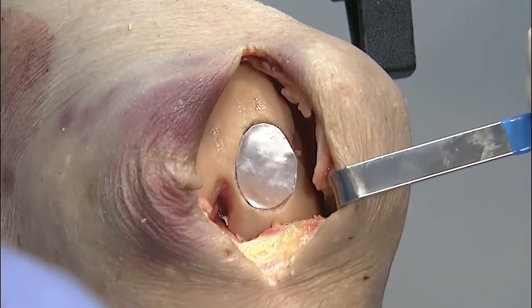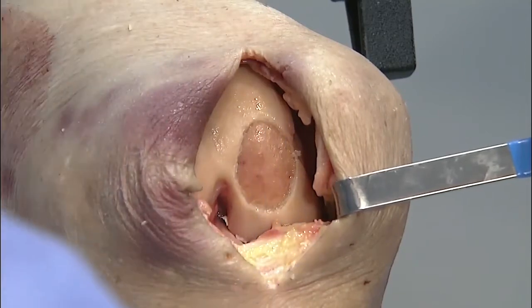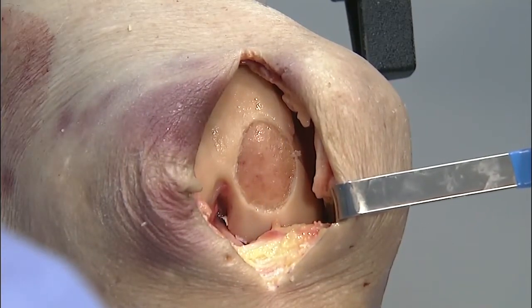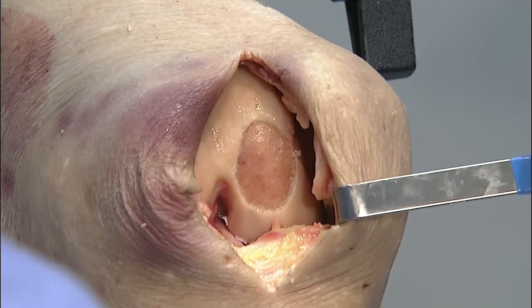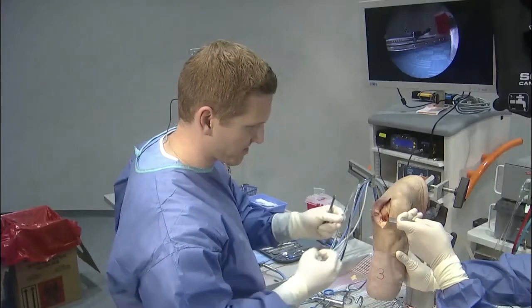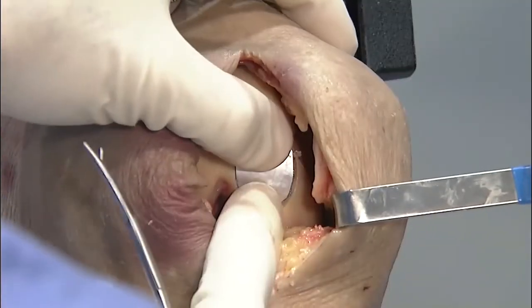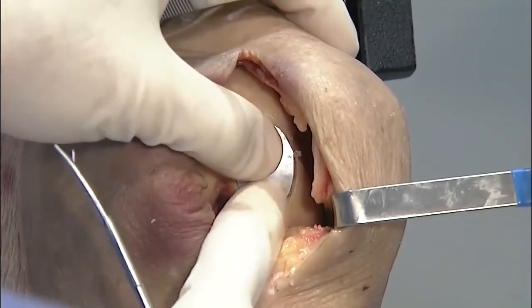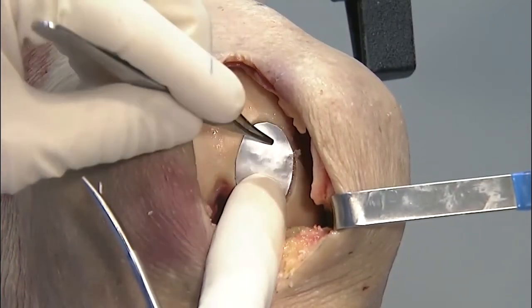Yeah, and like you said, you don't want it to be too big for sure. But if you have a tendency to cut on the outside of your foil when you put your actual graft on, you may want to keep your foil a little bit smaller, but that's just a personal thing based on how you cut. This is the part of the operation I slow down, and if you're going to use this foil, it's got to be perfect, just absolutely perfect. So to me, that looks very acceptable there.